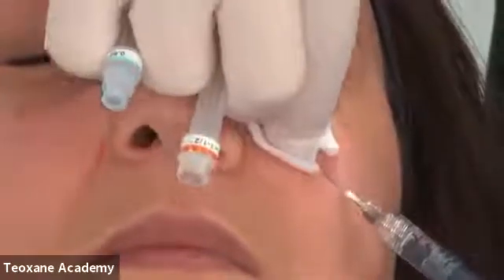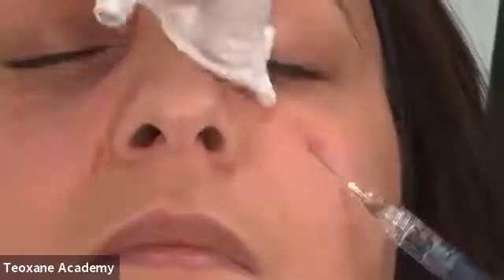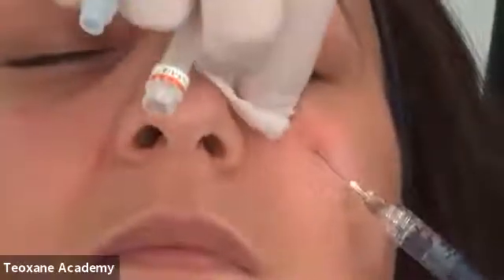And I will inject on this side, not with an anterograde, but to show you another technique, with a retrograde injection. And I will inject 0.3 ml of product here, going slowly, and I prefer not to overcorrect. It means I prefer to put less than too much. And I will put an average of 0.3 ml of product in this area. I finish my 0.3. I do a little massage of this area, as you can see. It's not a massage, it's a molding of the product. And then I keep only 0.2 ml of product.